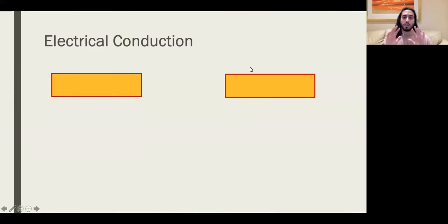So the important thing to start off is right down to the basics in terms of what an ECG is. An ECG is basically a graphical viewpoint of the electrical activity that is happening in the heart. Okay, and the way that this works is that the heart consists of many different small myocytes, which are basically cardiac muscles that can have some action potentials and that can have some electrical energy. Okay, so to understand how that activity corresponds to the physical thing that we see in the ECG, we need to understand a little bit about electrodes.